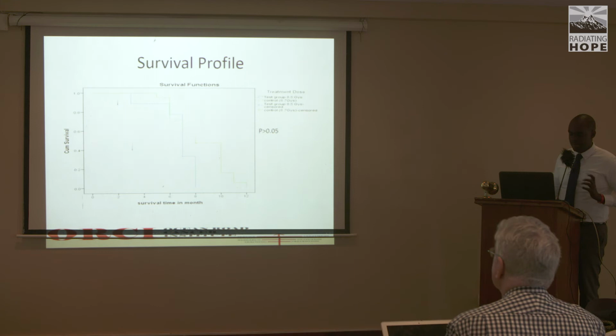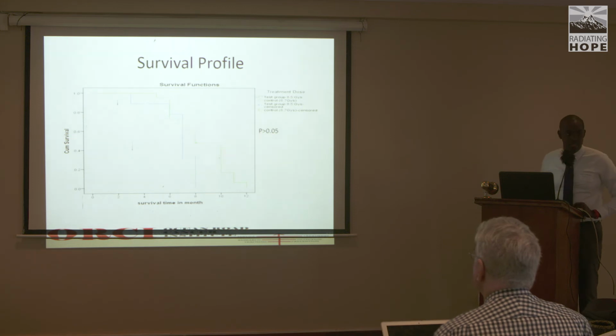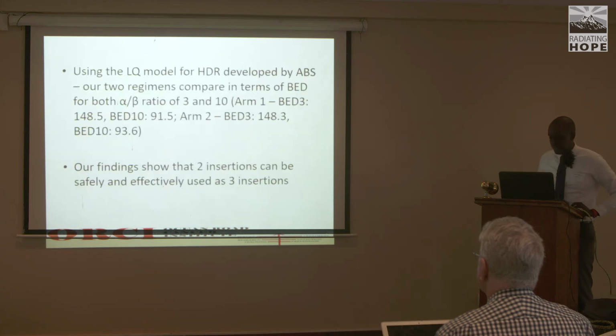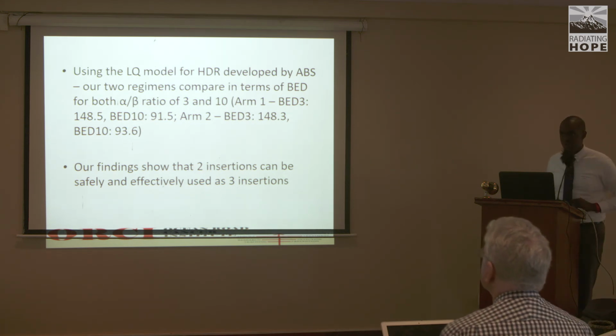At 9 months, my statistician really argued the point, but we didn't have any difference between the two. Perhaps with a longer follow-up we could see a difference. Now, there is an LQ model that was created by the American Brachytherapy Society, which is now developed as well by the University of Vienna, and they developed an LQ model for HDR.